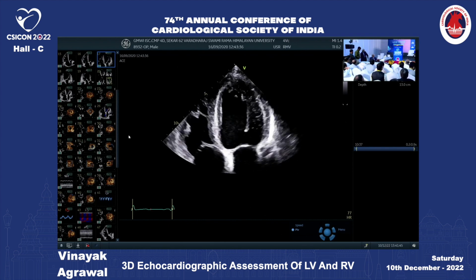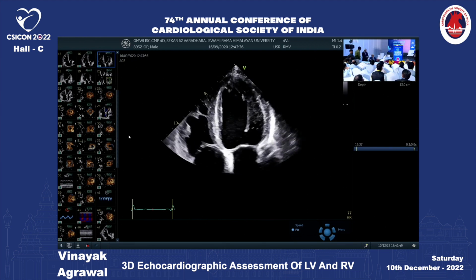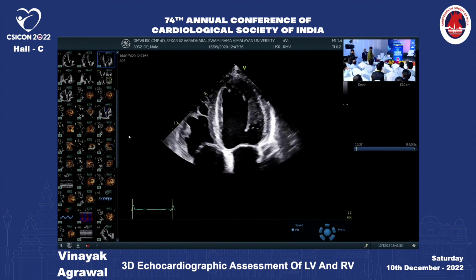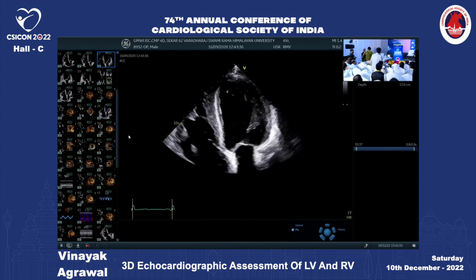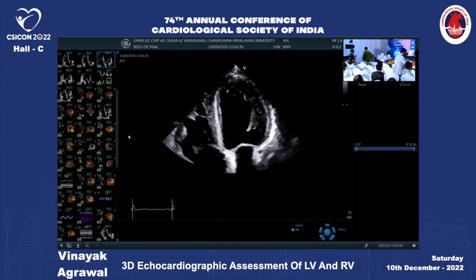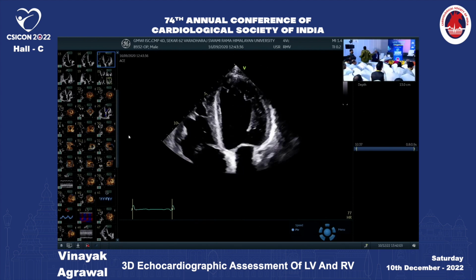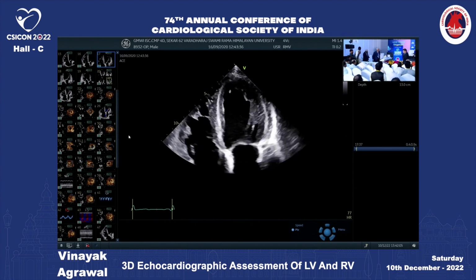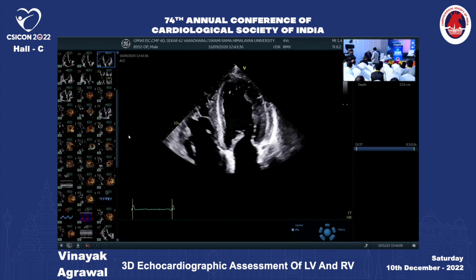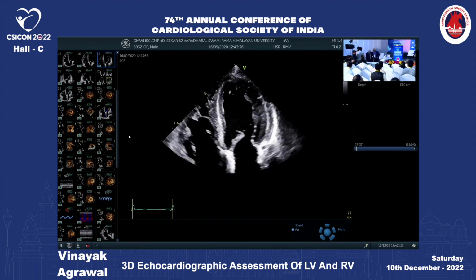When we studied echocardiography, we were always taught to use the right hand. You should always look at the anatomy. Again, when we were teaching students, we always stressed that anatomy is the most important information that you should have before you do echocardiography. So the RV is medial to the LV, and then you are saying now you go laterally.